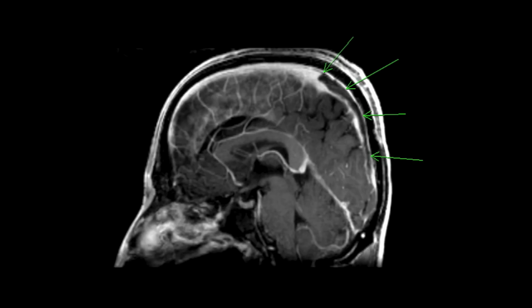This is a sagittal image of a Bravo sequence demonstrating an entire length of clot in the superior sagittal sinus as depicted by the arrows in this picture.